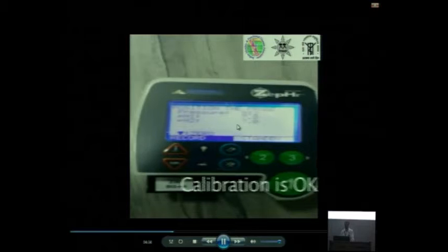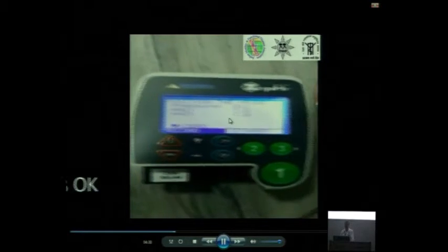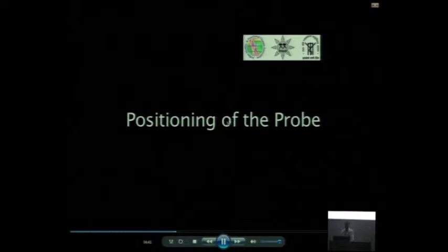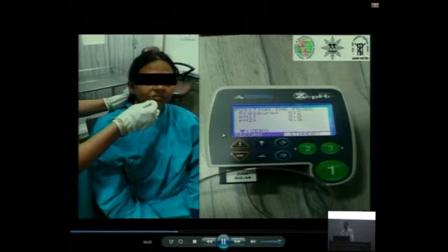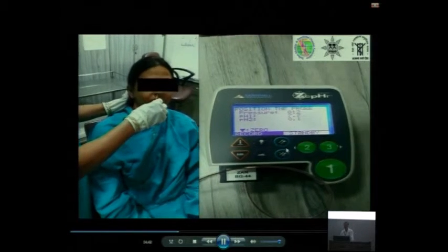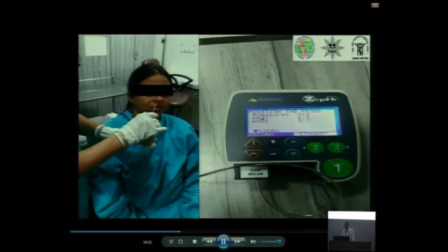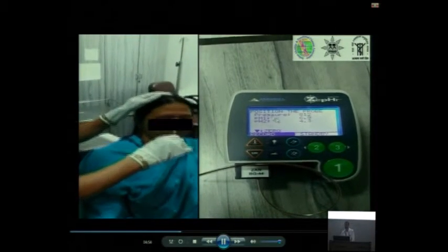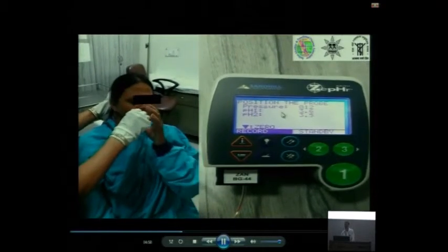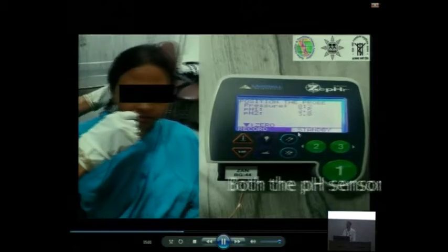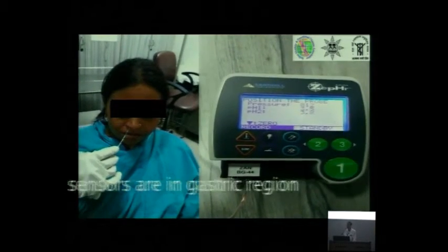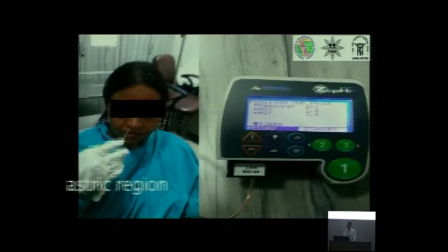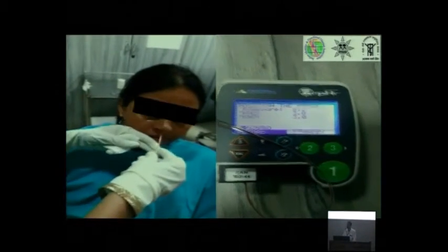Look at this. It tells pH port 1. It is stabilizing. Now subsequently, what you do is okay. Look at this, there is the values. Now we have gone to the esophagus. This is the esophagus. That's why pH1 is showing 6 and pH2 is showing 4. We have gone into the stomach. The second one has gone in the stomach. Both have gone into the stomach. Typically we go, both ports should be in the stomach. We have gone to the stomach, and you see both pH1 and pH2 shows you value of 3, means we have gone to the stomach.